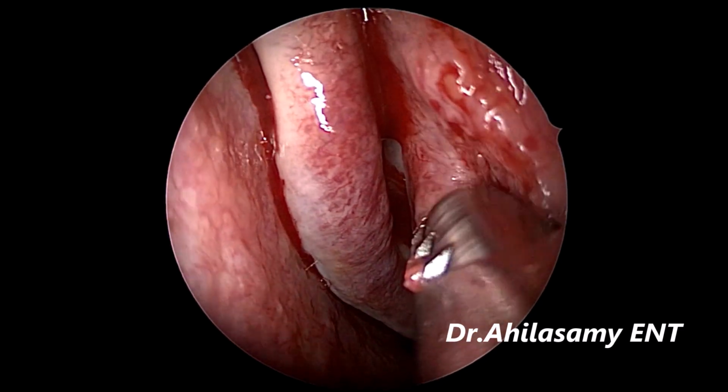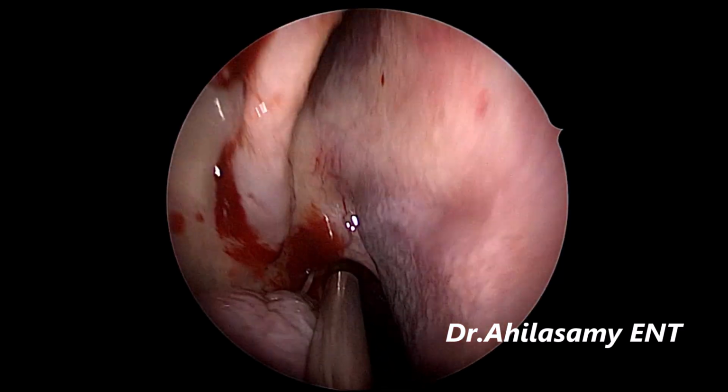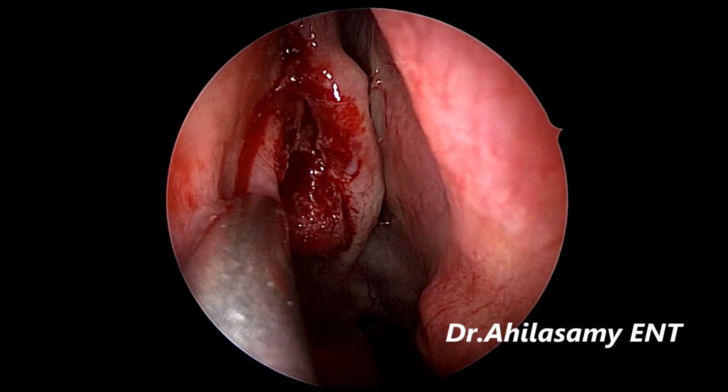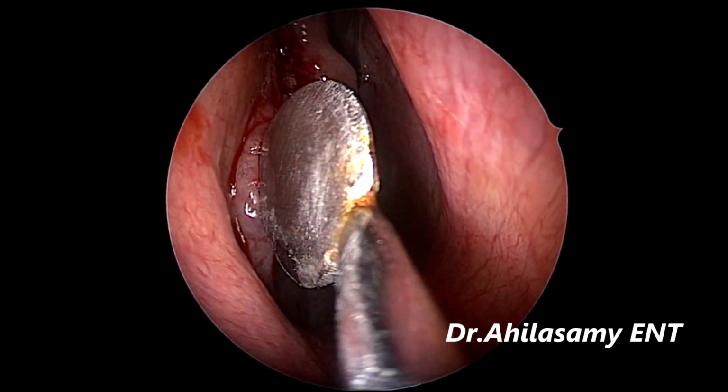Do not injure the septum, middle turbinate, inferior turbinate. Just touch only the polyp. Now we have come back to the right side. Sucking the blood collected in the choana. Don't trickle too much blood into the choana. Either ask the patient to swallow or you suck it. Otherwise, the patient will aspirate.